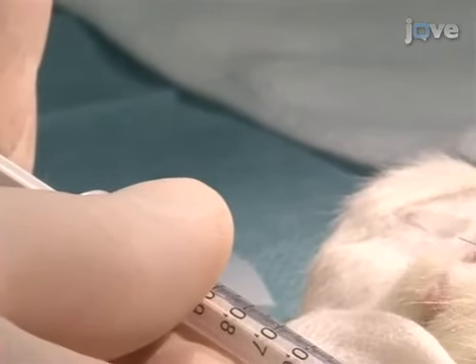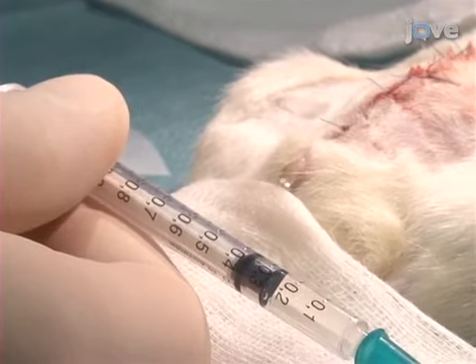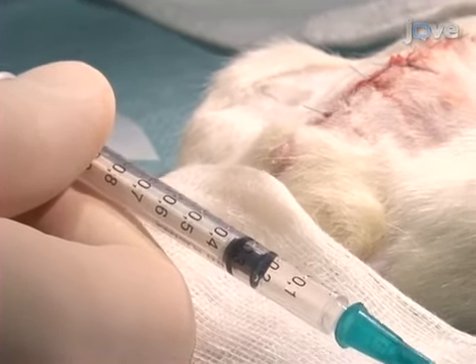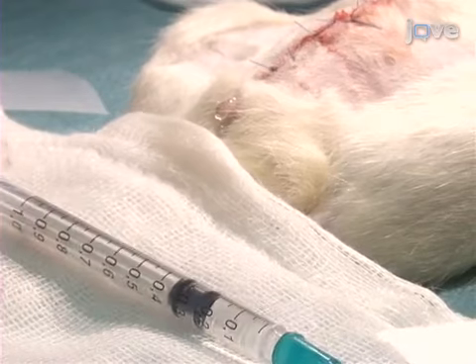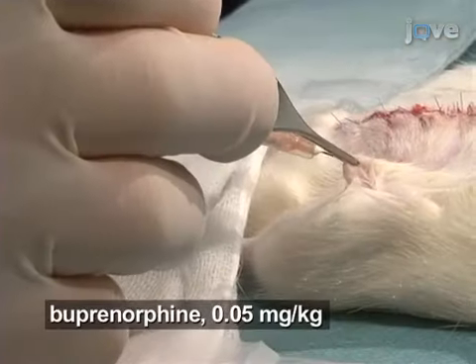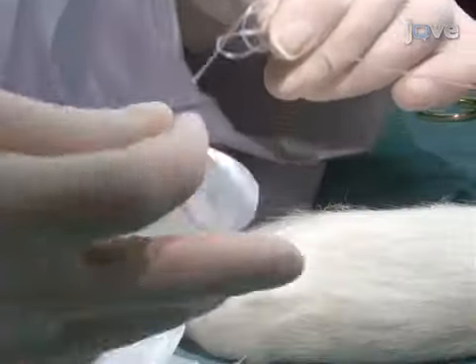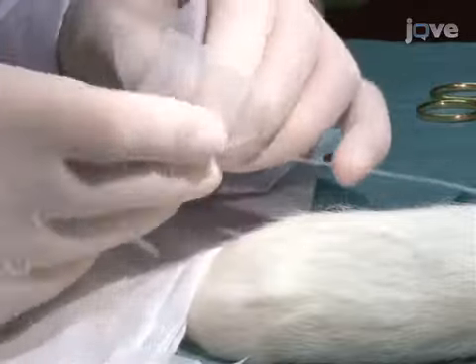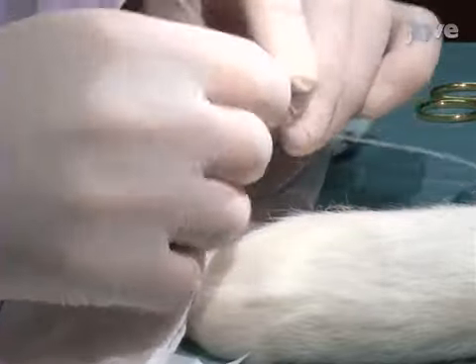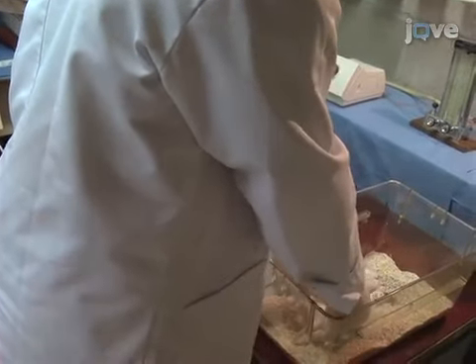It is now very important to check the permeability and stability of the implanted catheter by flushing it with saline. The infusion solution should exit the bladder via the urethra. After delivering analgesics subcutaneously, close the external end of the catheter with a plastic film and anchor the catheter to the skin of the lower back of the rat. Finally, allow the animal to recover for 30 minutes.